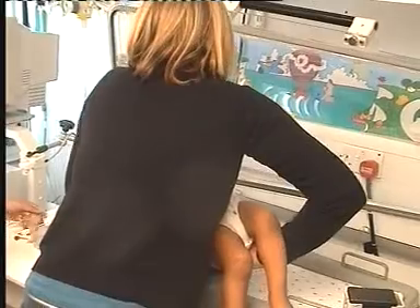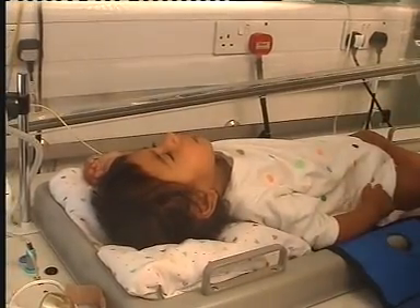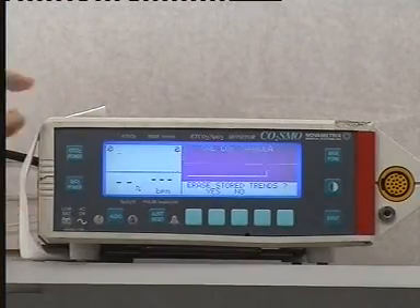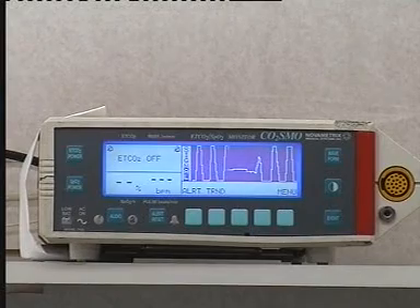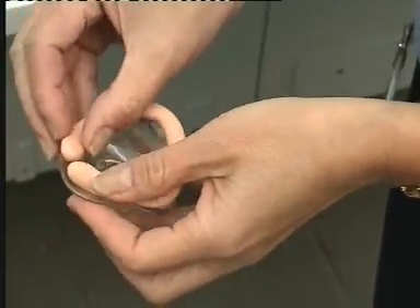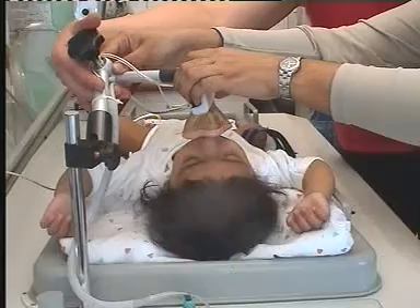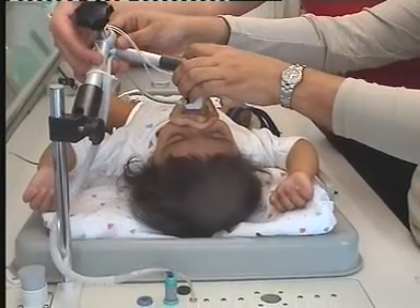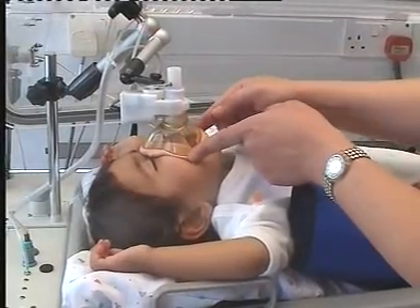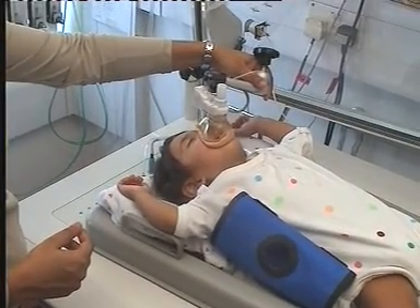Once the child is sleeping quietly, they are gently moved to the infant lung function testing room and placed within the infant plethysmograph. Parents are welcome to stay throughout the tests. A pulse oximeter sensor is attached to the baby's foot to monitor heart rate and oxygen levels throughout the entire testing procedure. During the breathing tests, the baby will breathe through a small face mask, gently sealed to the face using a ring of soft putty. The mask, attached to the pneumotach and shutter, is placed over the mouth and nose. The neck should be extended slightly, with the operator ensuring there is no depression of the jaw when positioning the face mask.